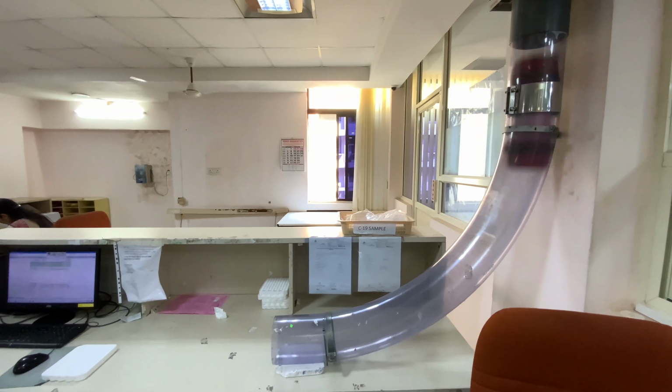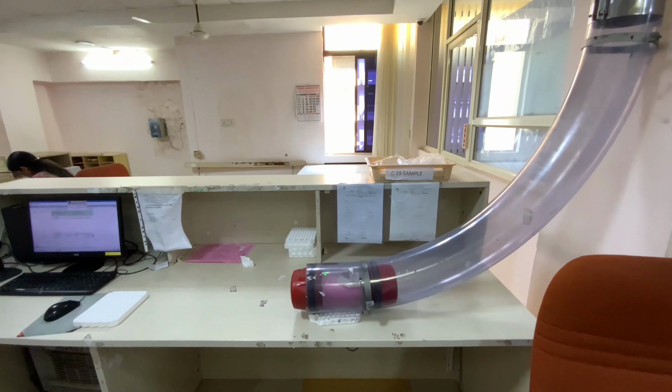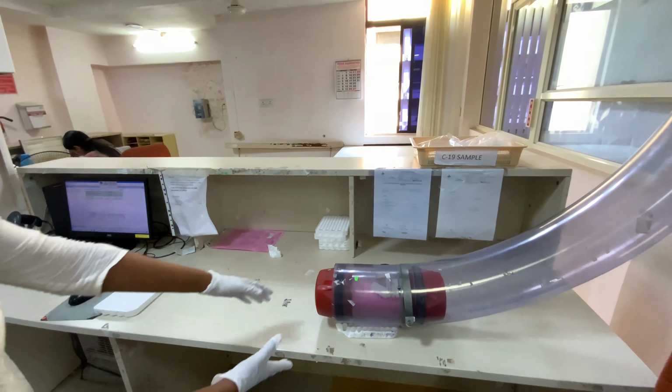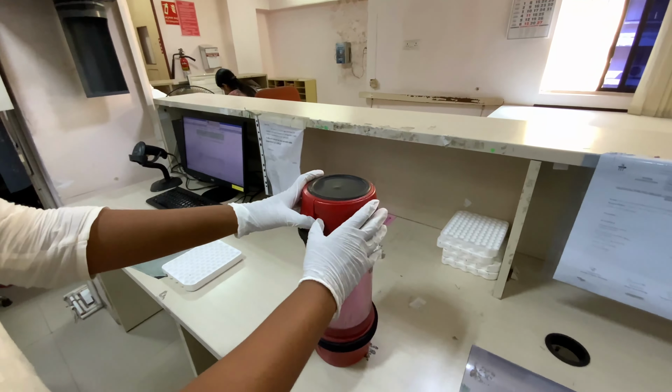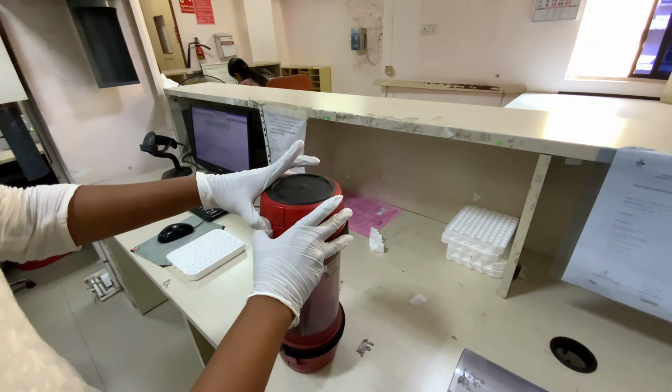The samples arrive to the lab via the pneumatic chute. The box is opened and the samples and the test request form are taken out.